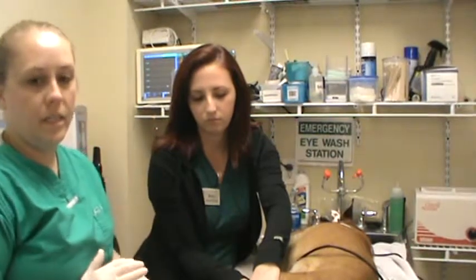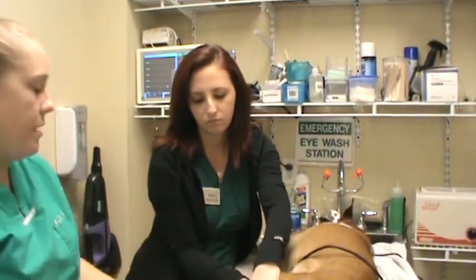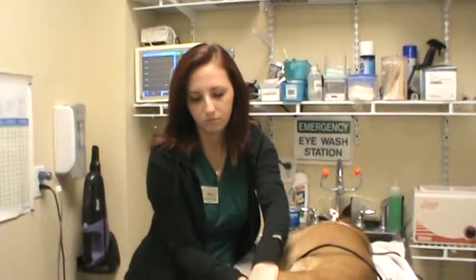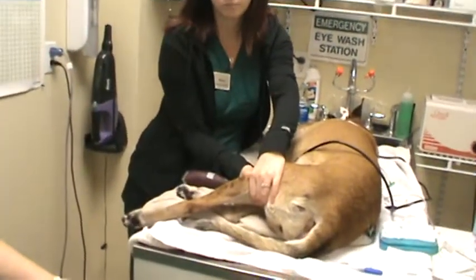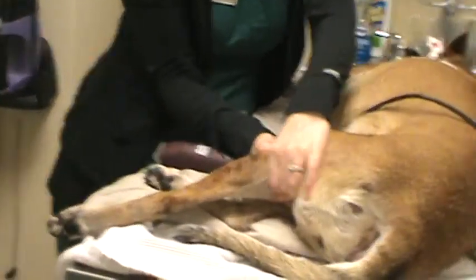This is Chelsea for VETT 220, test 44. We're going to go ahead and place an IV catheter in our patient here that's going to have a procedure today. So we're going to do the lateral saphenous. And I'm going to zoom in on our supplies here.